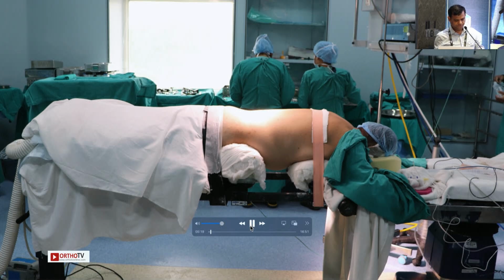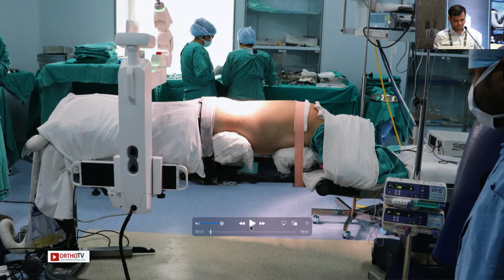Again, if you are using a pre-op CT, some people use pre-op CT with the robot. That is a problem because the anatomy changes while positioning. One has to be very careful, because if the spine is flexible, the whole thing changes when you position the patient. So one has to be very careful about this.